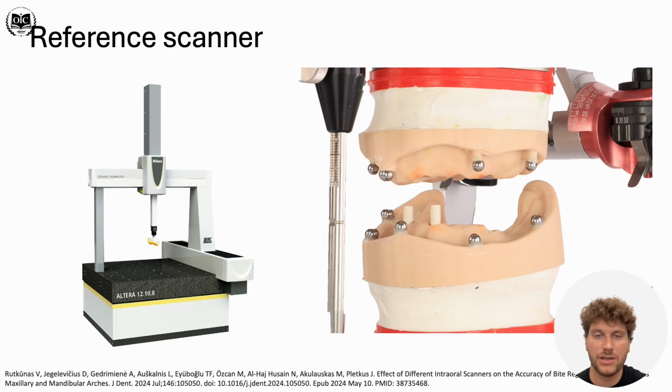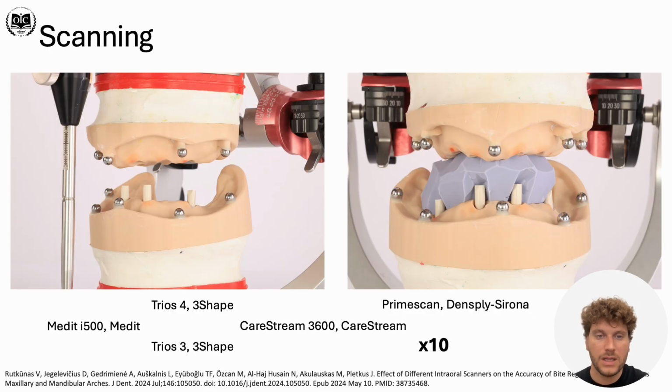We measured the maxillomandibular distances, and then we came up with a silicone impression that we can use quite easily in our dental practice to fix in between the jaws of the patient, and then we can record the maxillomandibular relation of the patient.